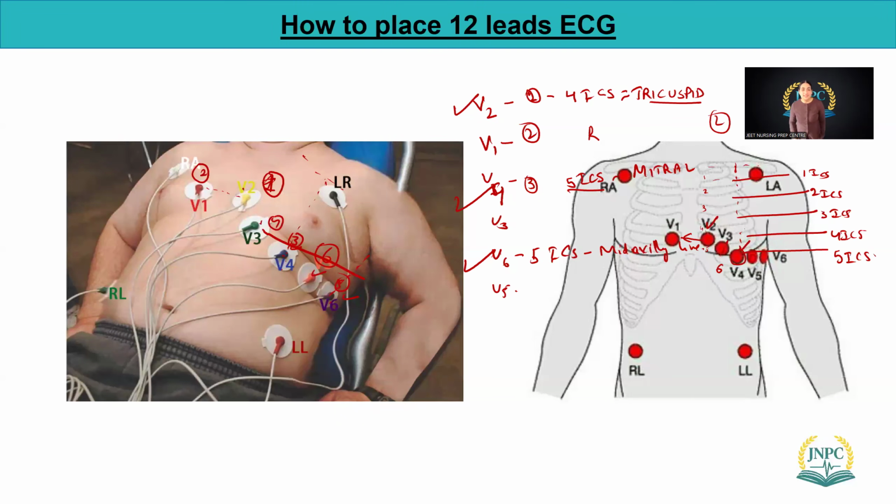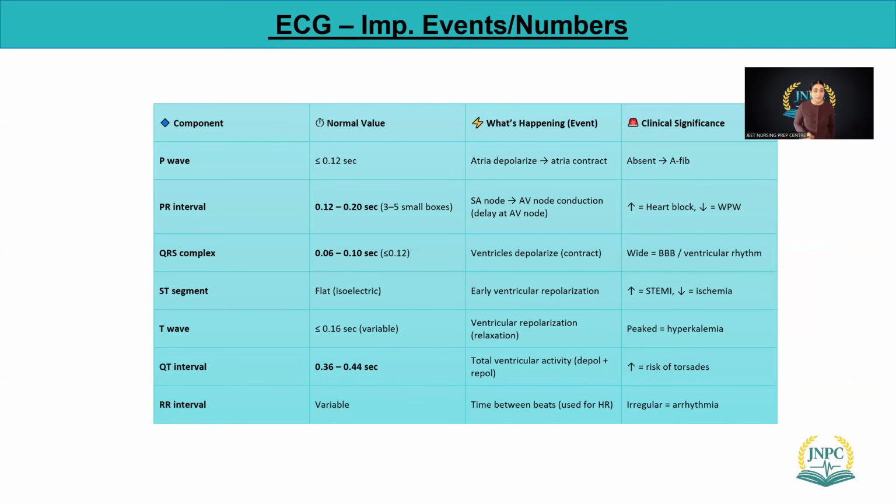Okay. If it is easy, let's go further. So these are very important events. If patients are obese, you need to use the common logic where it should be. If they're obese, you cannot see, but you have the idea. And here we have the heart around this area. So that's why we should be pro in that.